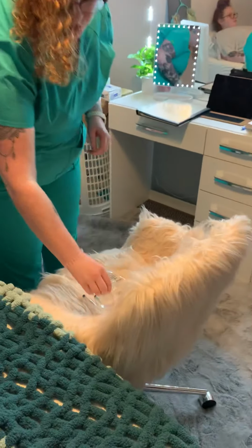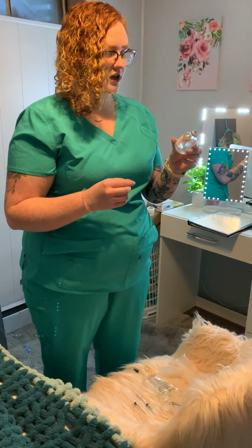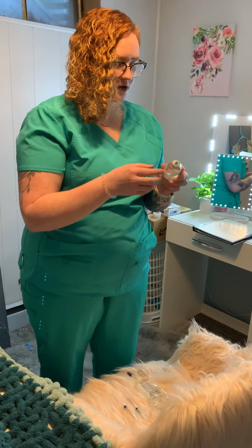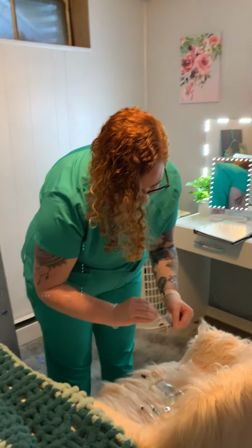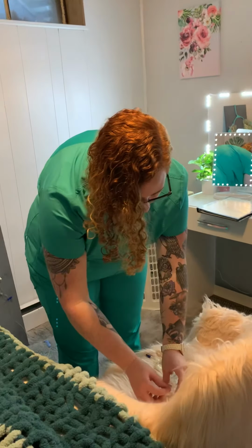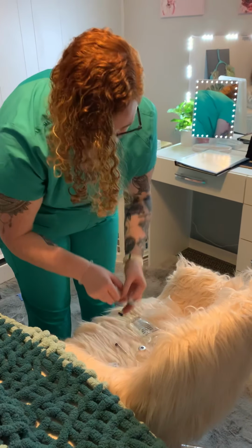And this is where the third check of the famotidine will take place to ensure injection of the correct medication into the IV bag. Since there is 20 milligrams per mL of this famotidine, we will draw up 1 mL for 20 milligrams to be injected into the IV bag.